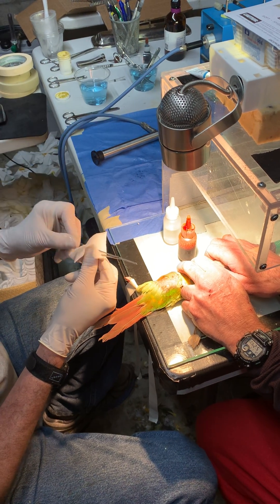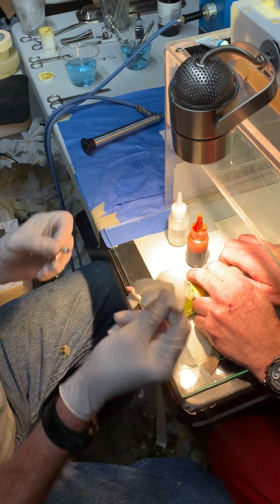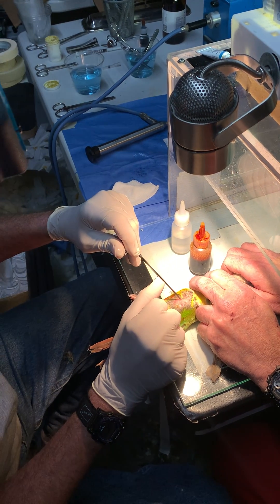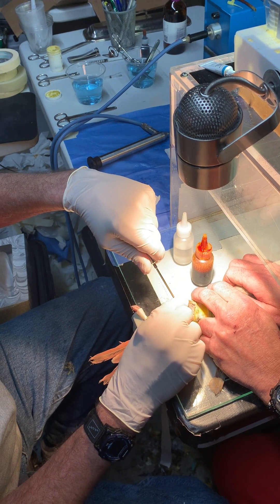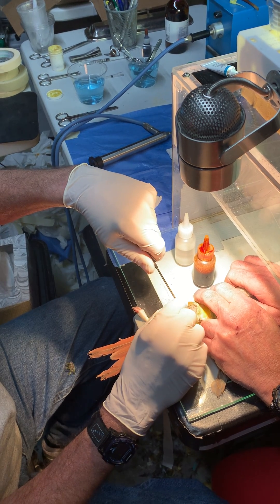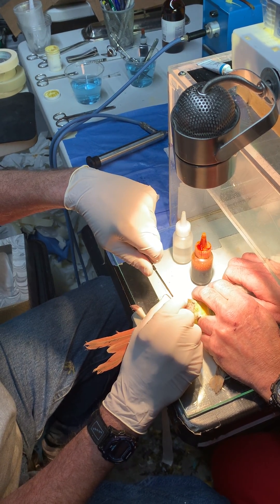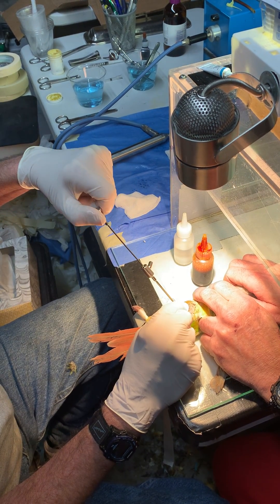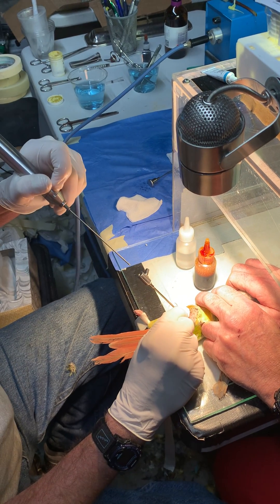This is a trocar and a cannula — it's kind of like a glorified nail. We're going to put that right up against the skin, just in front of the leg bone, and carefully push that through the skin and the muscular layer. It will enter into the air sac. Once we're in the air sac, we pull out the trocar and the cannula acts like a little tunnel going into the bird.